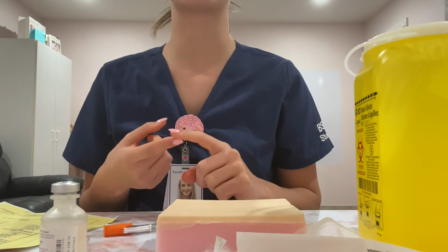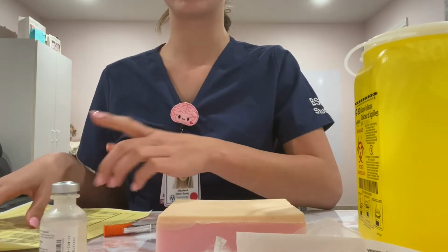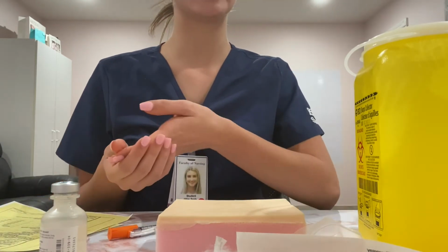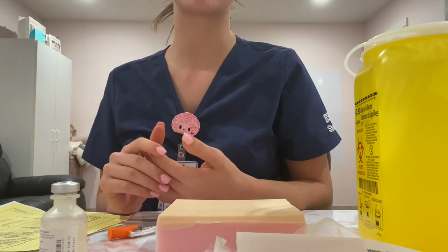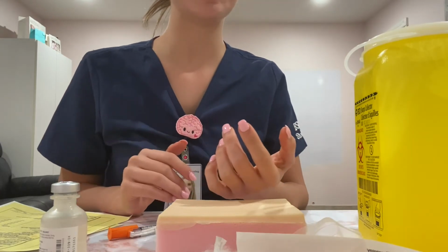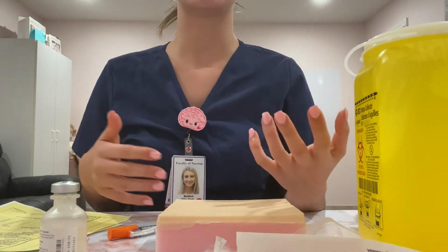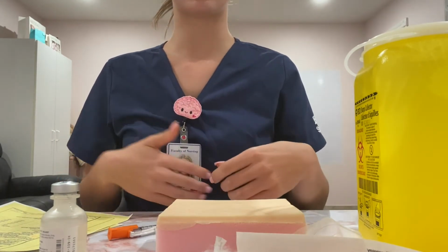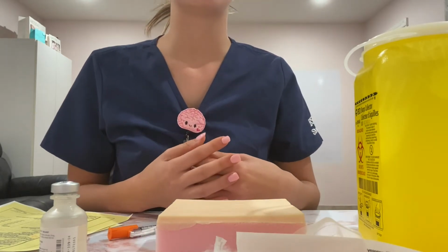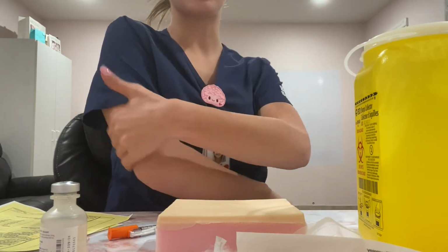and then I'd check that with their wristband and make sure that it matches, and then also the wristband with the MAR and what the patient says. At this time, before proceeding, I would verify any allergies and explain to the patient, and then identify their knowledge of the procedure. And then for the site of choice, I'm going to use the abdomen, because it tends to be the best site because there's a lot of adipose tissue to inject into, which helps with absorption. But I can also inject into the anterior thigh or the posterior upper arm if needed.